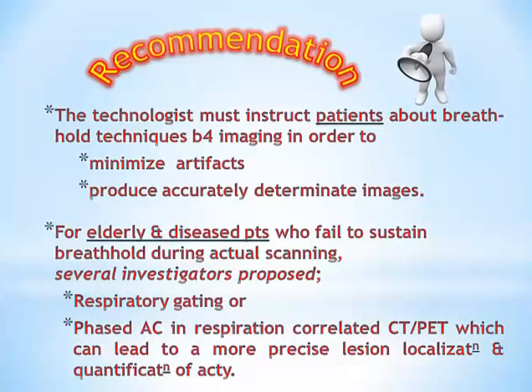So as a recommendation, the technologist must instruct patients about breath-hold techniques before imaging in order to minimize artifacts, producing accurately determined images. On the other hand, for elderly and diseased patients who fail to sustain breath hold during actual scanning, several investigators proposed either respiratory gating or phased attenuation correction and respiration-correlated CT PET, which can lead to more precise lesion localization and quantification of activity.